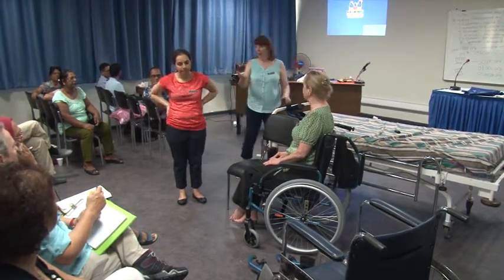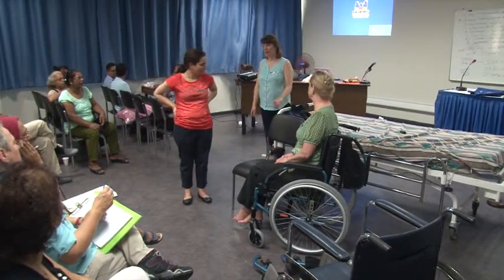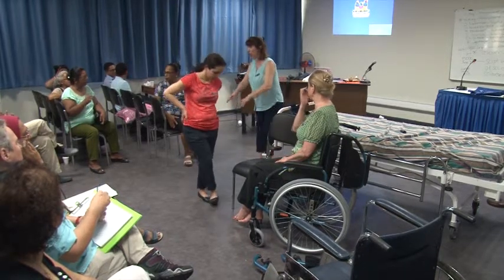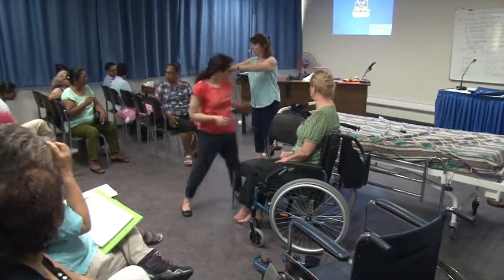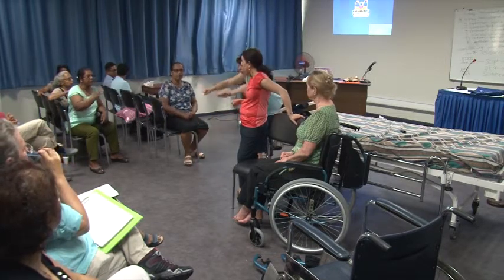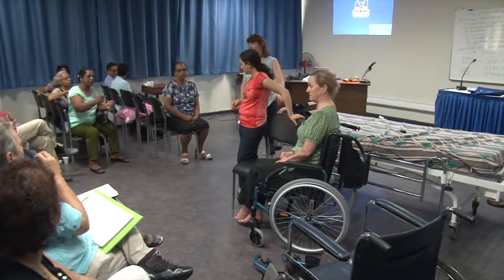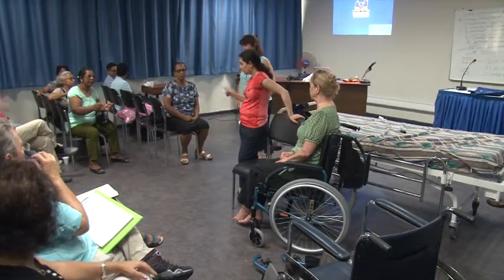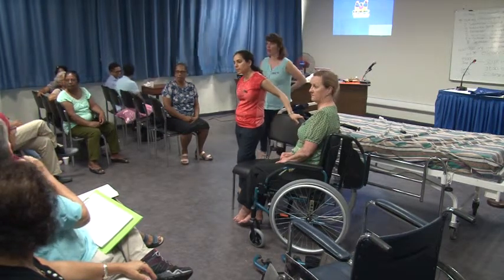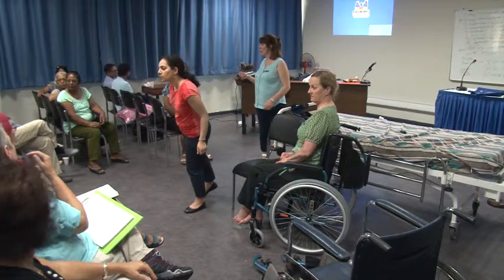And they're very good. I don't know if you have those here either, but the rotor stands are really handy for some patients. So it's a little plate. You put your feet on it. It has a bar and a handle, and underneath it has two little wheels and a tilt to make you stand up, tilt, rotor, and sit. It's called a rotor stand. I'll see if we can find a picture. Has anyone got internet?